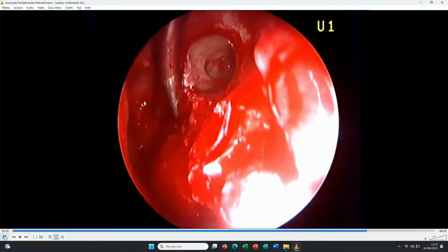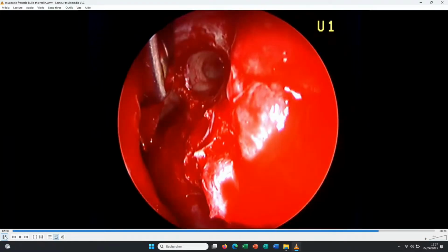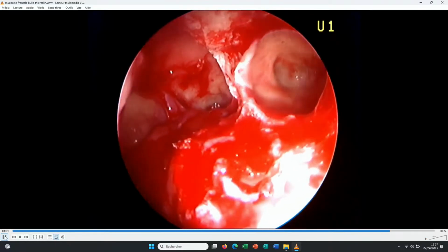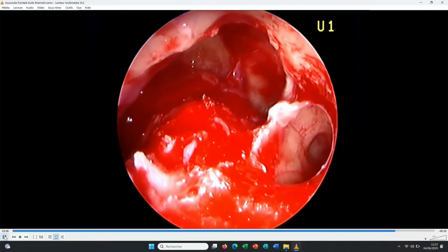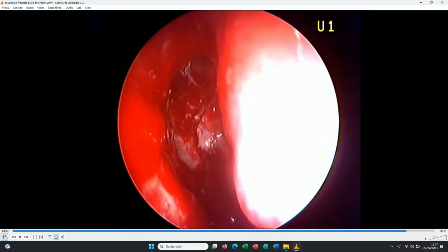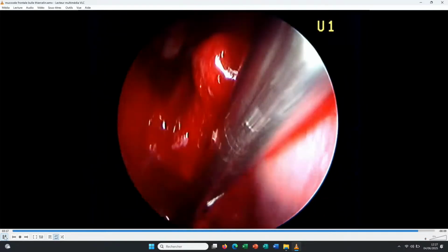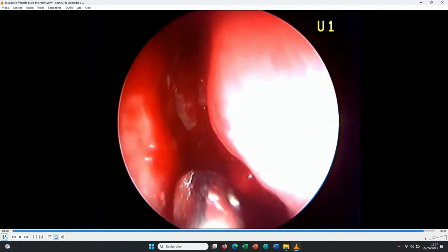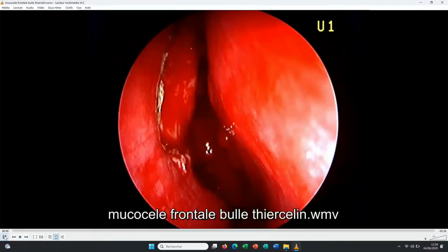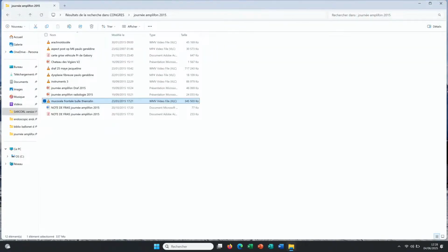So this is the end of the movie. To control the complete resection, it remains a piece of sheet. Okay, and correct. Now the result is obtained. So you can drill some small beak of bone, but the wall of the operative field is almost flat. So, okay, it is the end of the movie of yesterday.